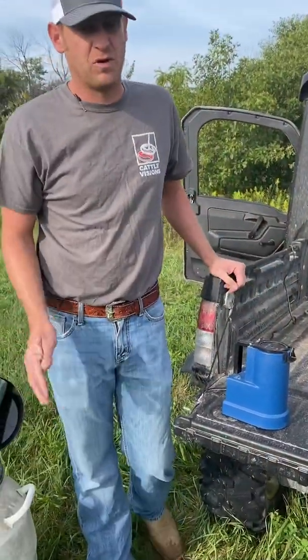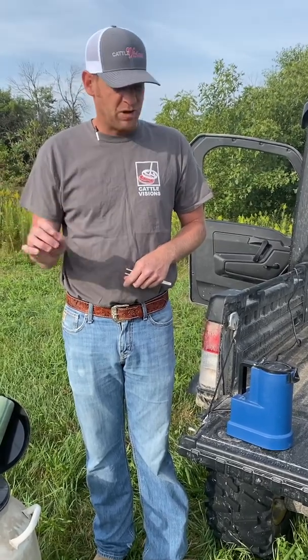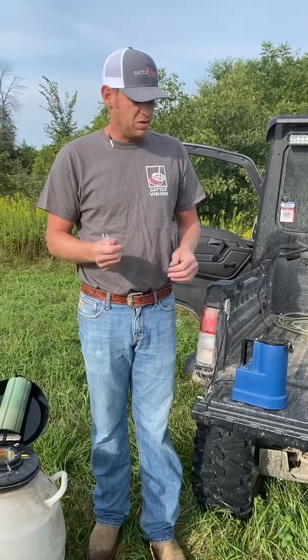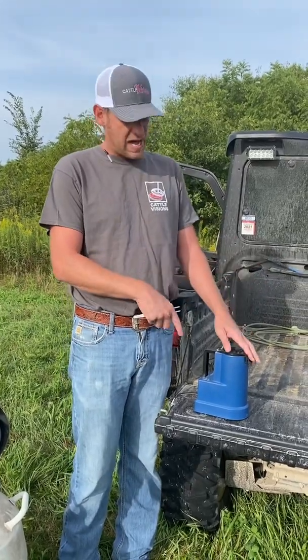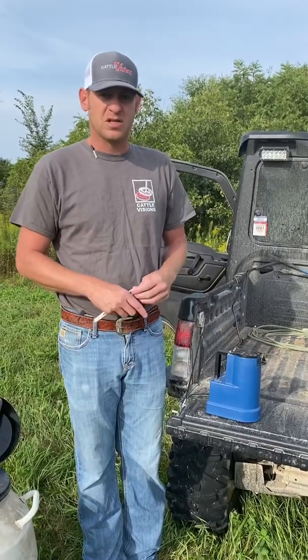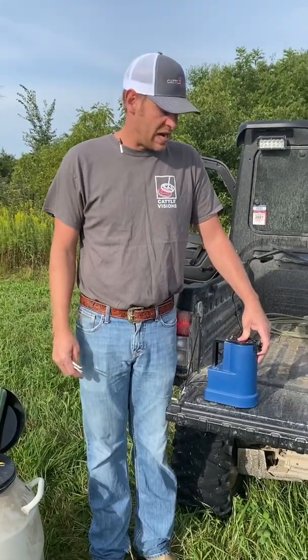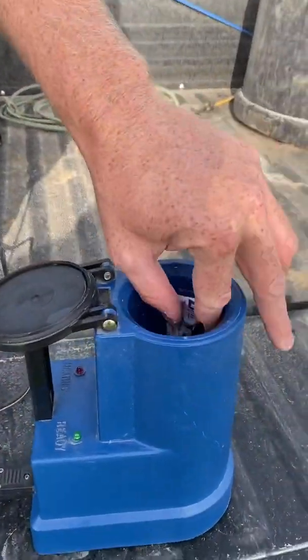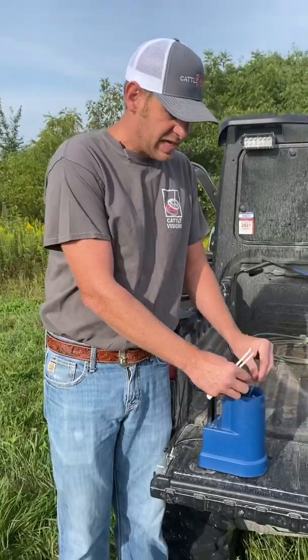My light's still on — I'm going to let this sit for around 30 seconds. You can go longer if you're mass breeding a bunch of cattle. Say you've got a heifer project with 30 cattle all being bred the same way — it's perfectly fine to take out three units of semen, put them in there for 15 minutes or so. But let's say we're doing one: we have our semen identified, it's in the thaw bath, we let it sit, and now my semen is thawed. My card says 96–98 degrees, so we're perfect. We pull that out and we're ready to go into the gun and into the cow.